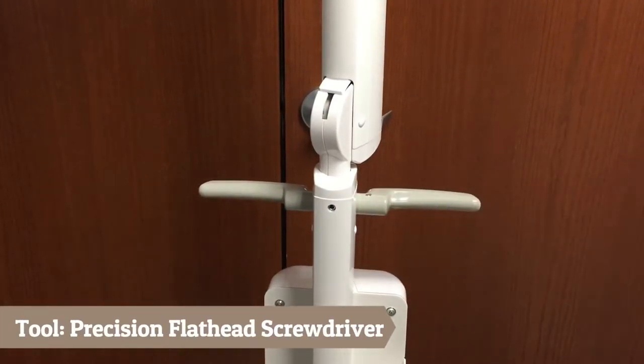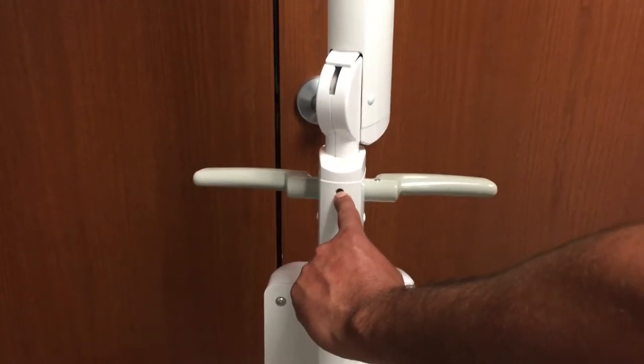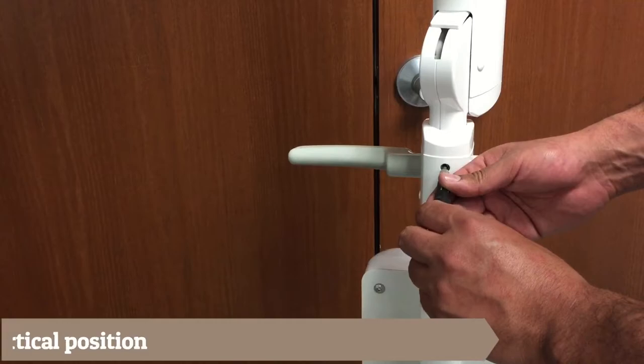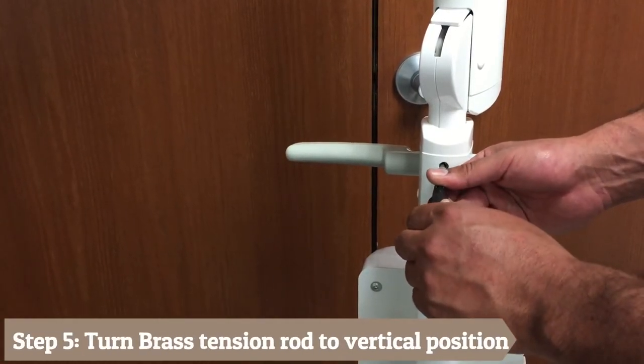Step 5: Once drift is no longer present, make sure the brass tension rod inside the set screw is in a vertical position. If not, use the precision screwdriver to adjust.